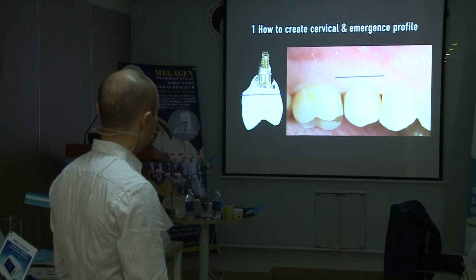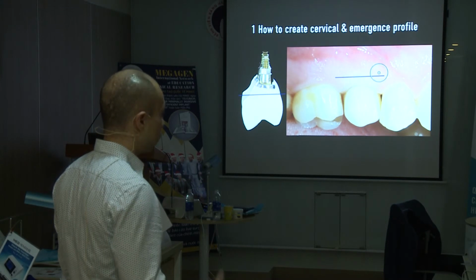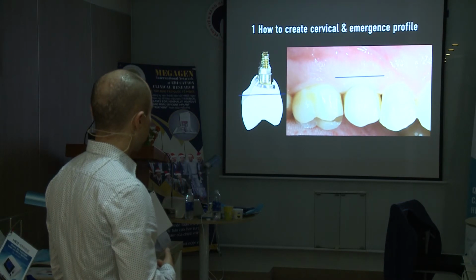And then we push it in, and you see the blanching because of the pressure on the soft tissue. It goes white.